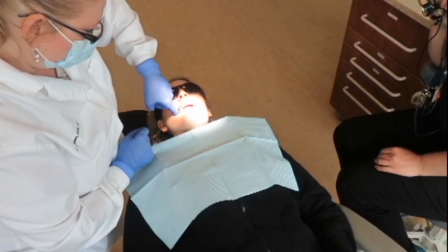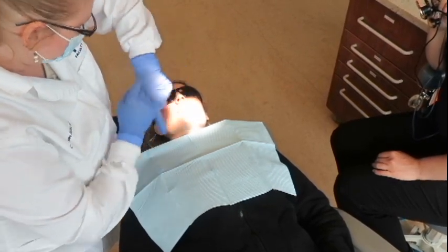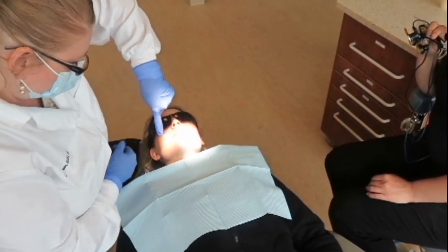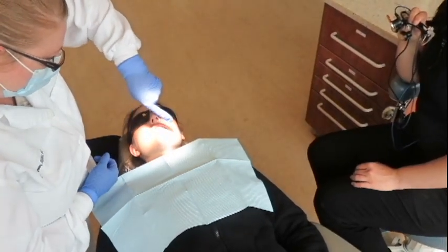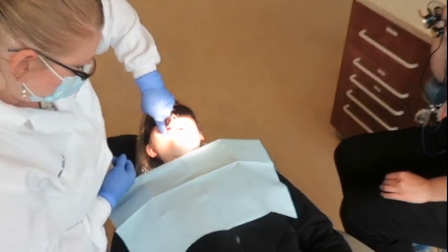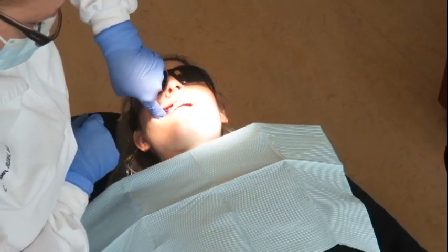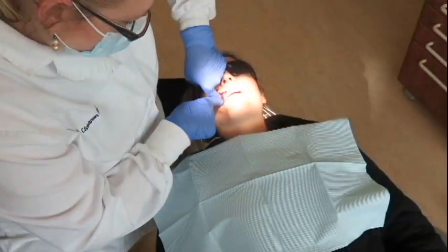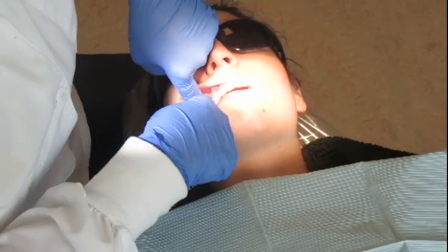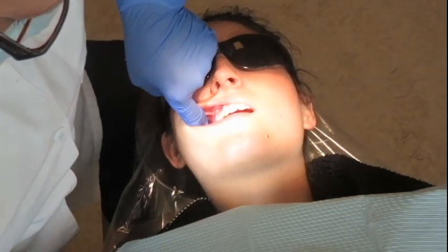For beginners, make a fist and then stick your index finger out straight. Get your elbow up in the air. The palm of your finger is pointing towards the top of the patient's head. Go ahead and have them open, and I'm going to palpate. There's the zygomatic strut. My finger is still straight — I follow it to the soft spot. That's my site. I'm going to be retracting straight out, giving a little bit more pressure with the very tip of my finger so that I tighten the tissue at the same time.